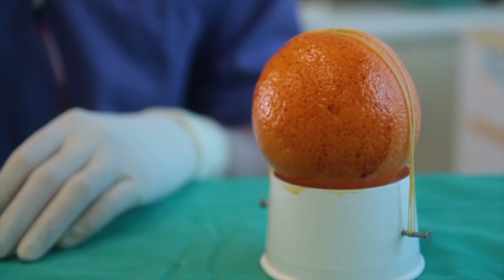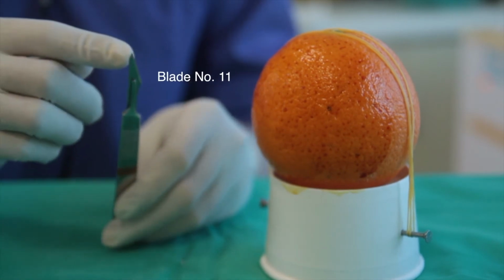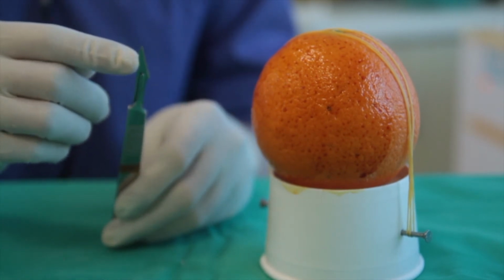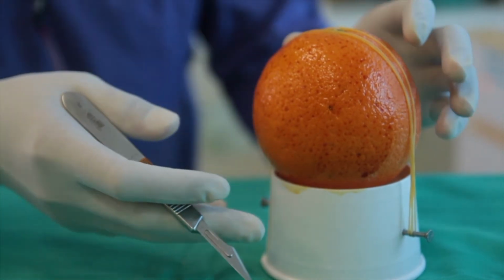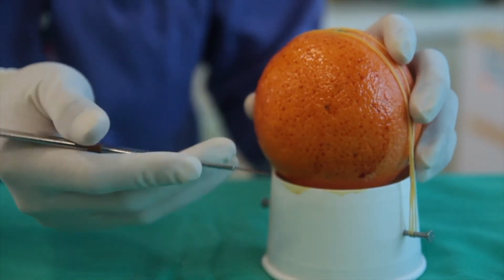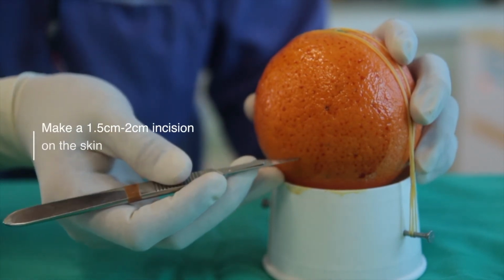The next step would be the incision itself, preferably using blade number 11, which has the pointy end here. We make a 1.5 to 2 cm incision on the skin.